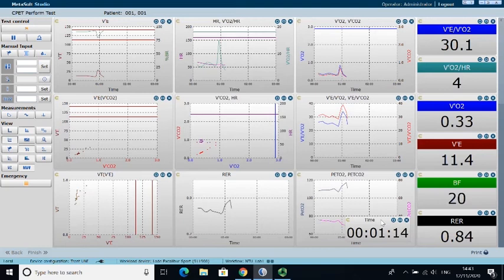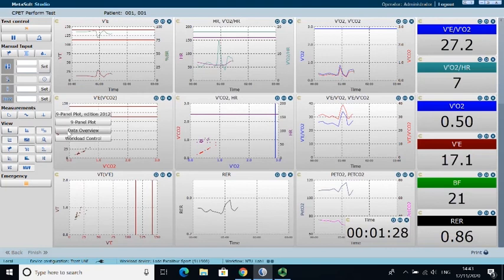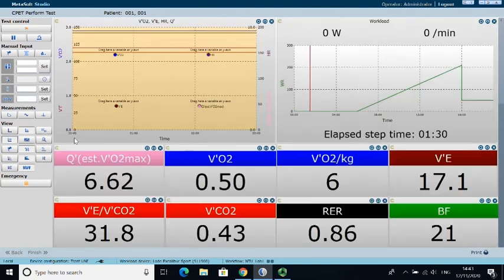I also make it clear at this point that they just keep going until they think their legs can't go any longer, and that they don't just stop because they hit a certain number or something like that. Now what we can see here is I'm flitting around the different things. I'm going to show you a few different screens here. If you want to, you can change the screen to a preset screen that you like to see.